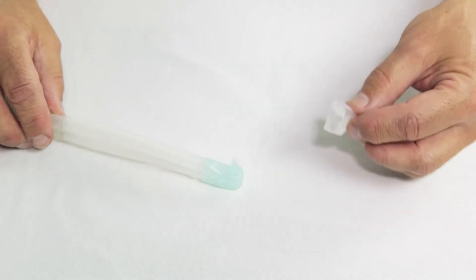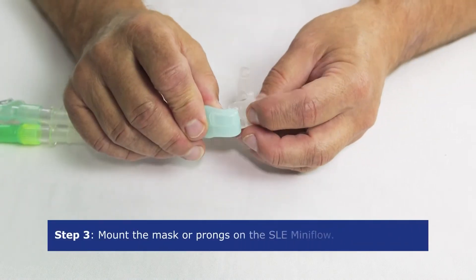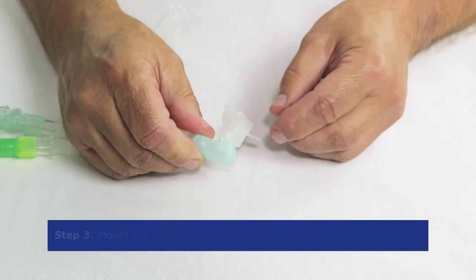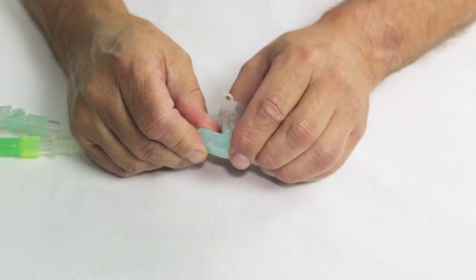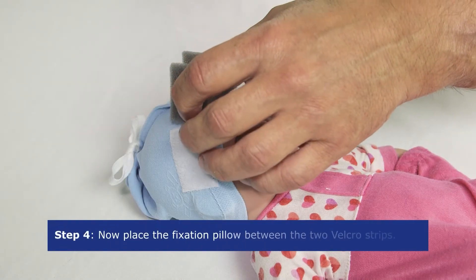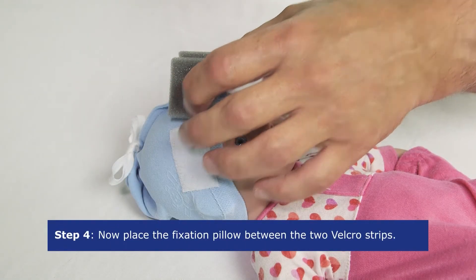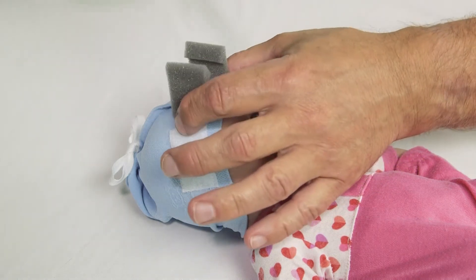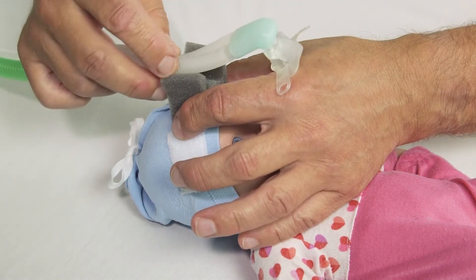Mount the mask or prongs on the SLE MiniFlow. Note that the angle at which the mask is mounted on the generator can be adjusted if necessary. Now take the fixation pillow and put it between the two velcro strips on the front of the bonnet. Place the generator tubes into the opening of the fixation pillow.